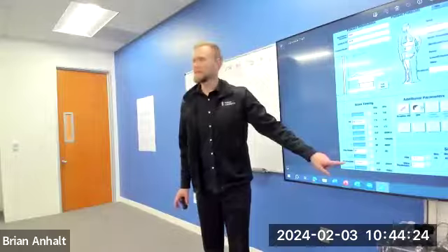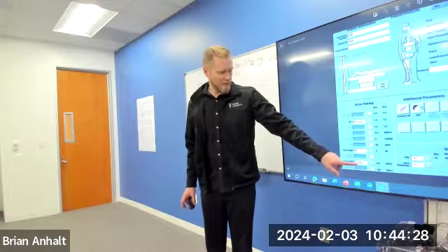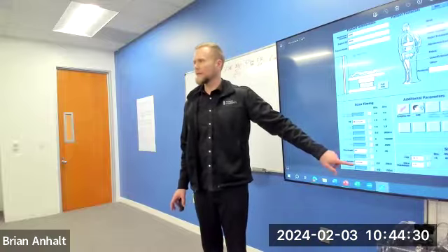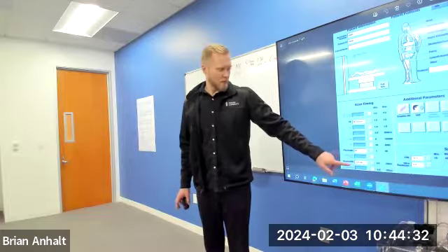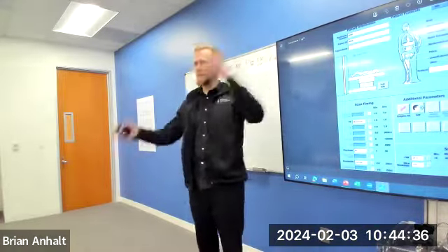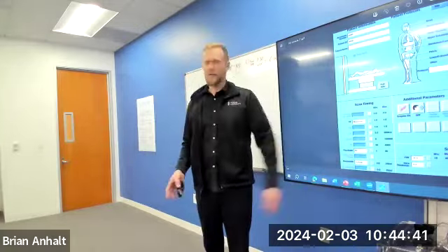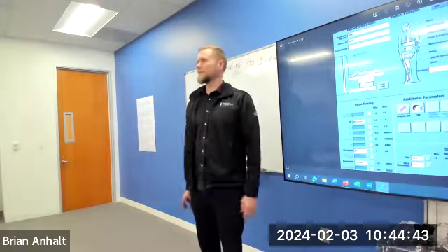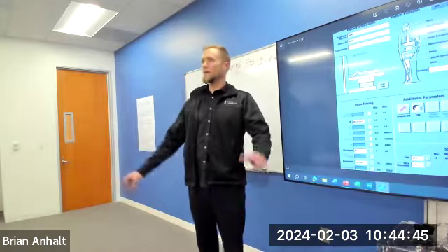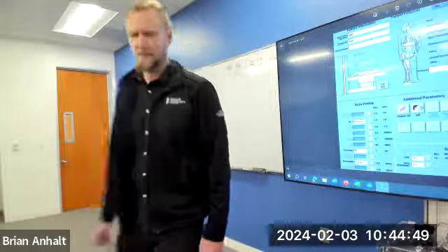There it is. 125. And on GE, this means plus or minus 125 kilohertz. That means the total bandwidth here is 250 kilohertz across the field of view that we're looking at, across the image. You can change this, right? I could say, no, I only want 60 kilohertz, or I want 50, or I want 300. That's something that you can change as an operator. But what is that doing to the system?